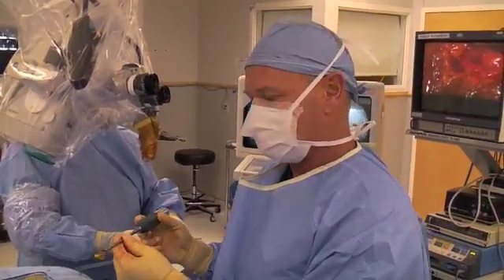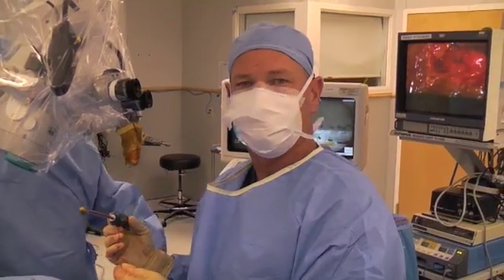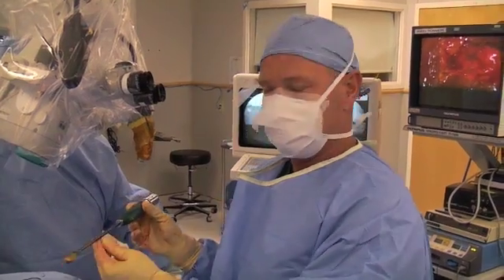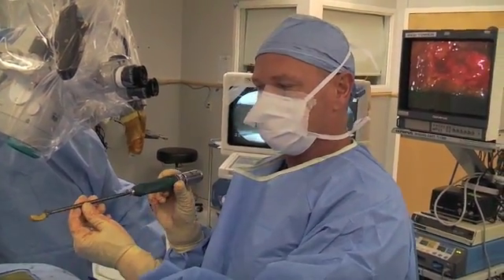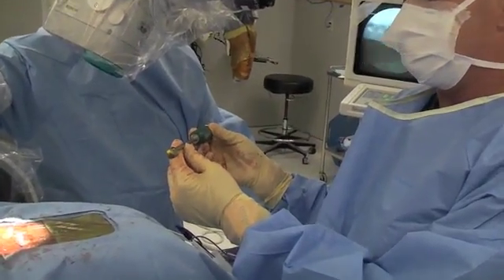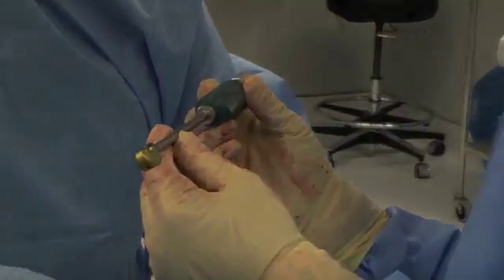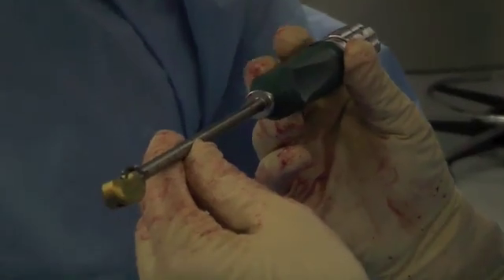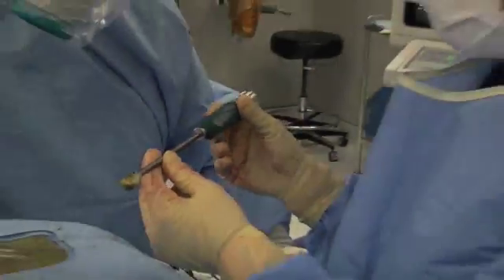Hi everybody, we're back where I'm most comfortable talking about what I like to talk about — in the operating room. It's the easiest place to show it. This is the new TPAL template, which is one of the main new features. I'd like to thank the inner body group for coming up with a perfect execution of all the cervical design principles that we all wanted to execute.